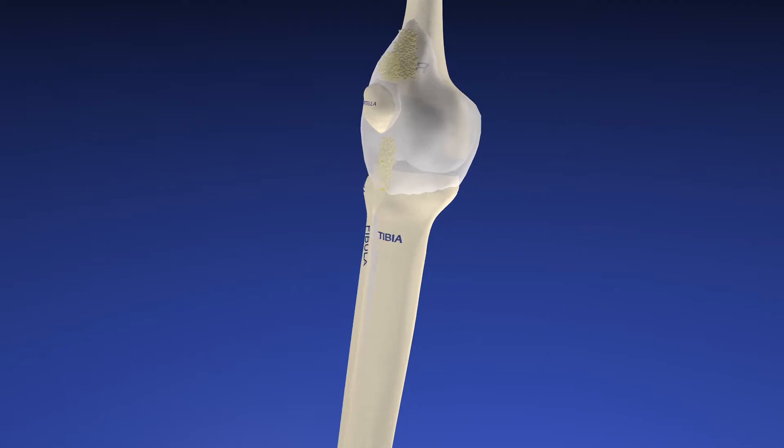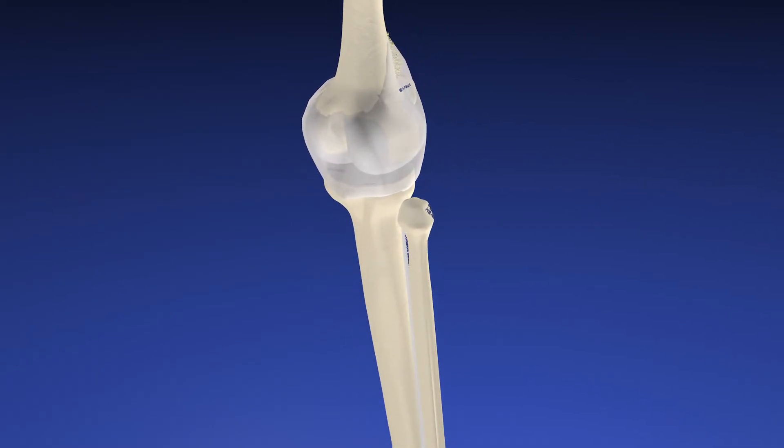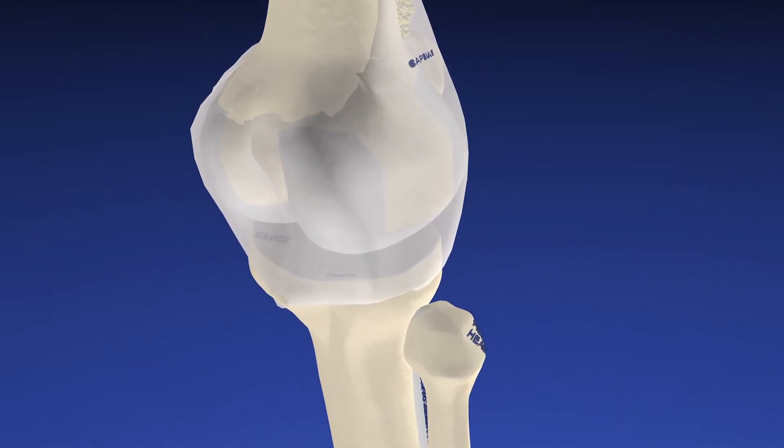First we're going to drain her knee. Then we're going to view some of the anatomy of the posterior knee, basically rotating to focus on the posterior region where Baker cysts are found.